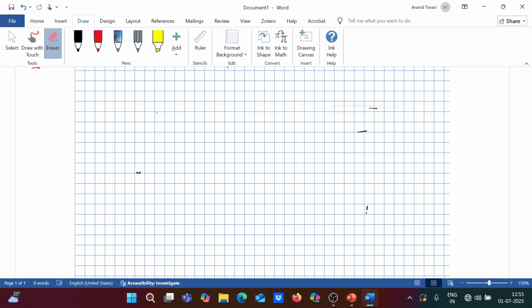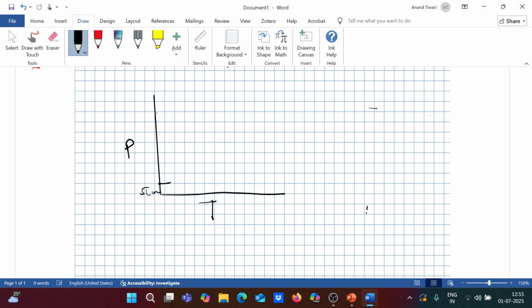So first important to understand, as I told, is the pressure time curve. So let me draw the pressure time curve. On the y-axis we take the pressure, on the x-axis we take the time. So what happens in volume control ventilation? We know that the airway resistance will be there. If we keep a baseline pressure, say this P, it starts from 5 centimeter water. So this is the baseline variable, and from here the pressure rises.